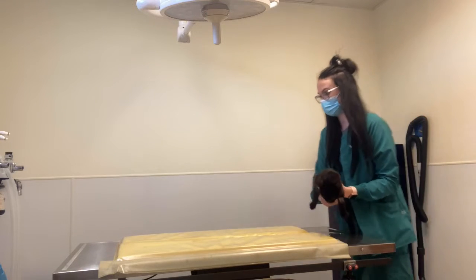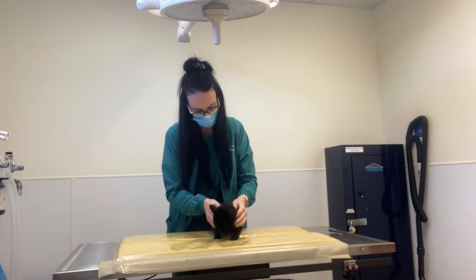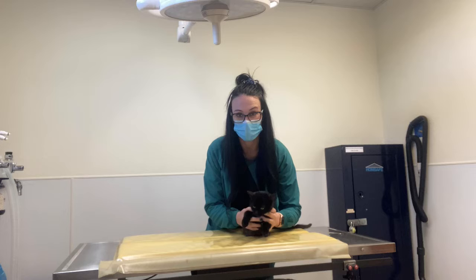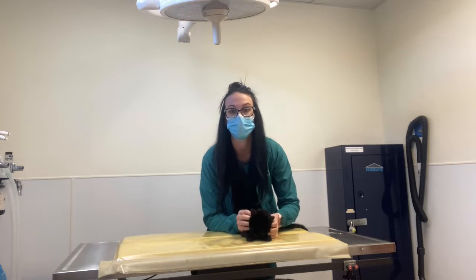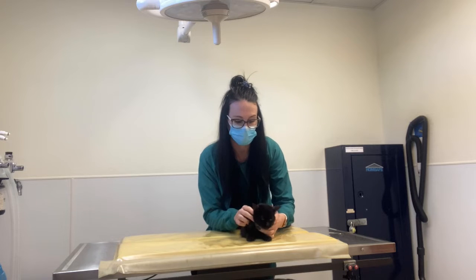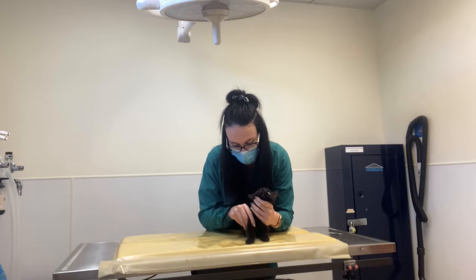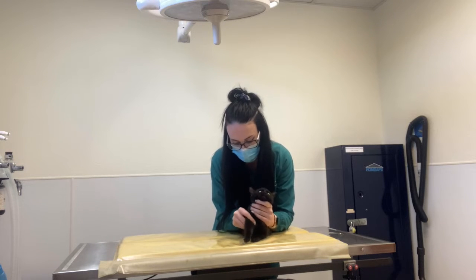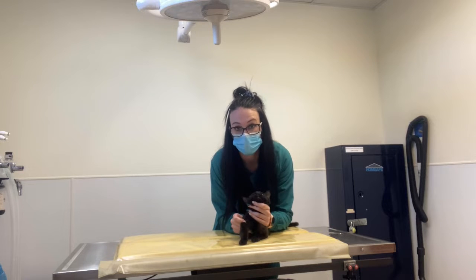As far as a cephalic vein, we can do that standing or laying, whatever she wants to do. So since she's so small, I don't have to hold her like a dog. I can just hold her with my hand like this, and then we're gonna put our thumb right behind her elbow so she can't jerk back, and we're just gonna roll our finger along the top of her leg to get that vein to pop out, and the technician can draw.